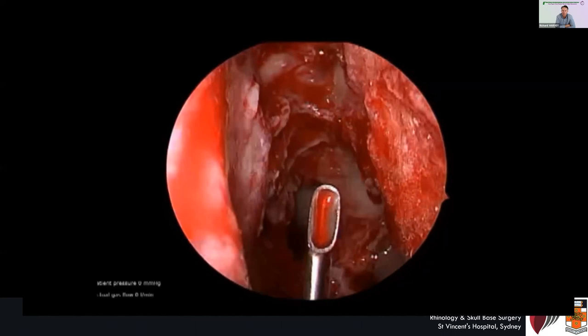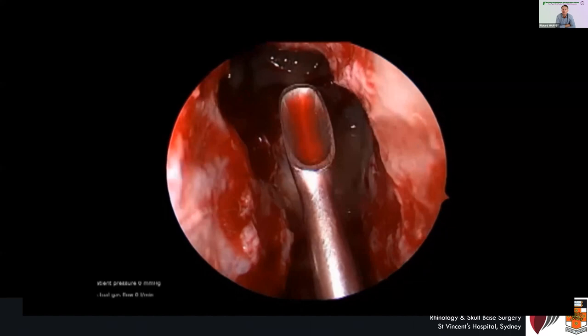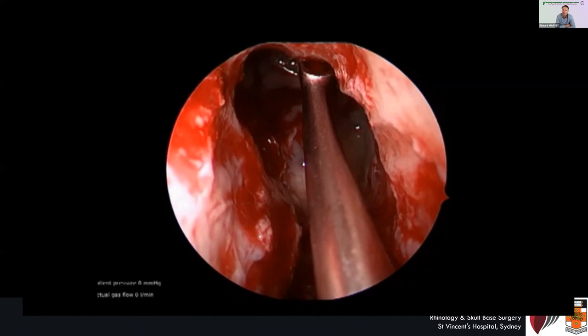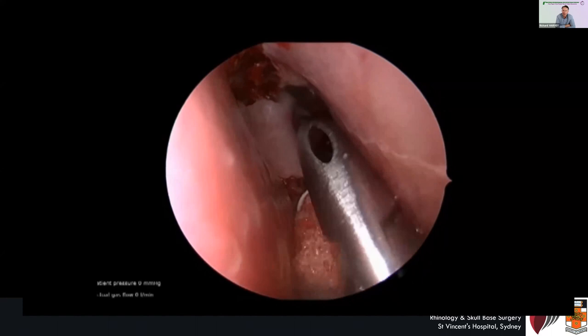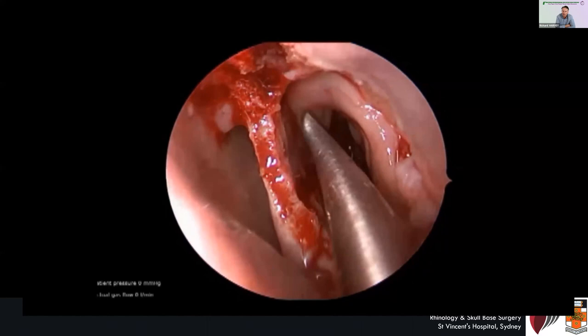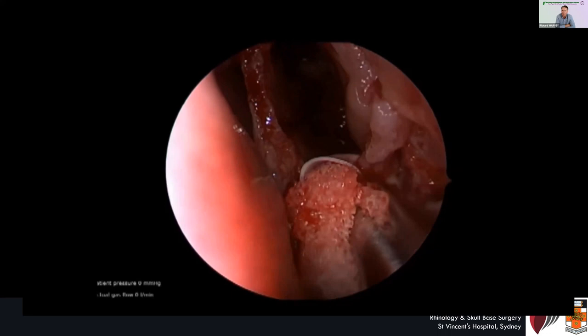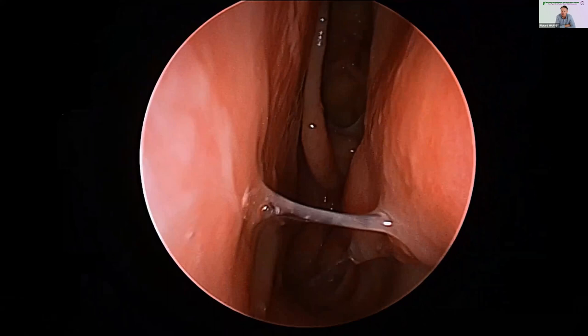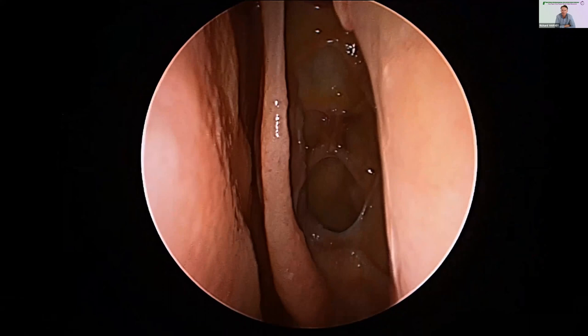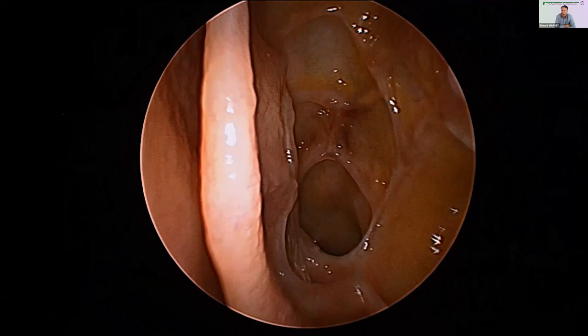You get this view here — the end cavity. When you look up, this is just a zero-degree scope looking up into the posterior table. The flap gets returned and there's no free graft over the main area. When you take the flap, there still is a little bit of raw bone, so we'd still put a tiny bit of free graft in. But the portion anteriorly was a small flap, and the flap always heals better than a free graft. When we started to preserve the mucosa and create a little flap, we got really nice healing — the cavity healed really nicely.